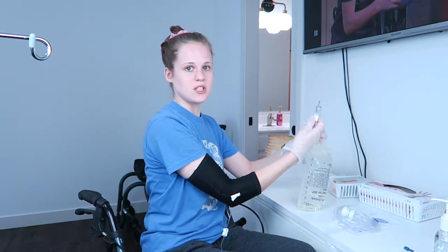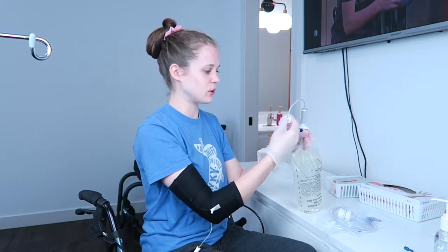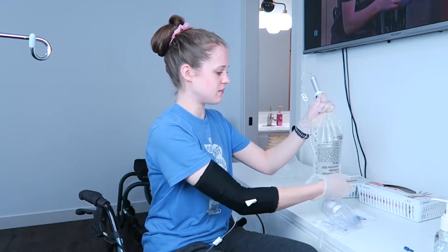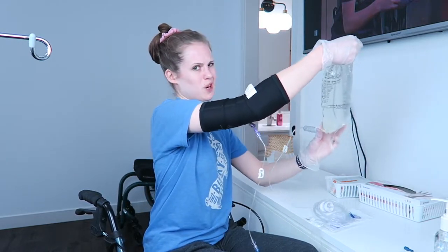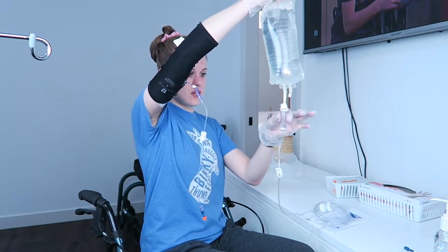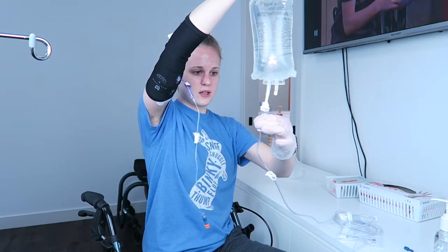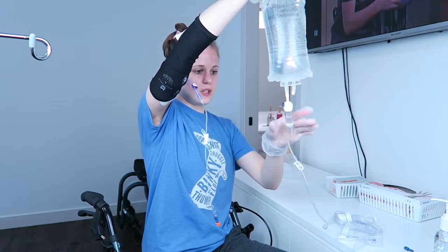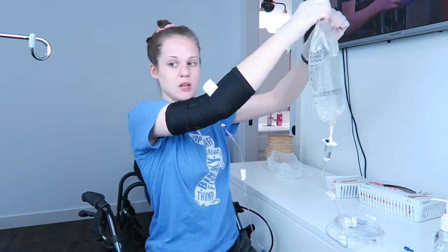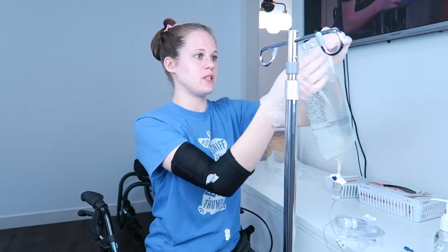So the tubing just has this little clamp on here. I know it's not super close up, so it's kind of informal instructions. So I'm just gonna clamp that and then flip this upside down or right side up, I don't know. And then I'm gonna squeeze the chamber and some fluid goes into the chamber when you do that. So I'm gonna squeeze it again. And then it's about half full. And that's what I want. There we go. Next, I'm gonna bring my IV pole over here and hang the fluids on it.